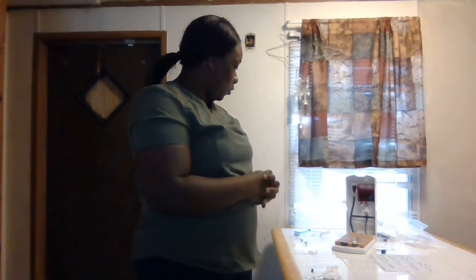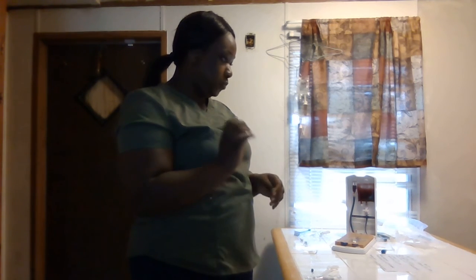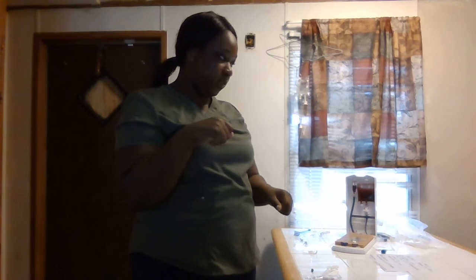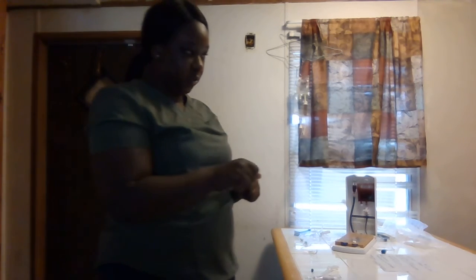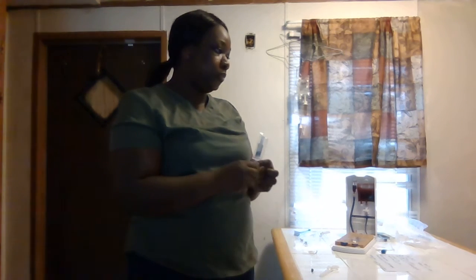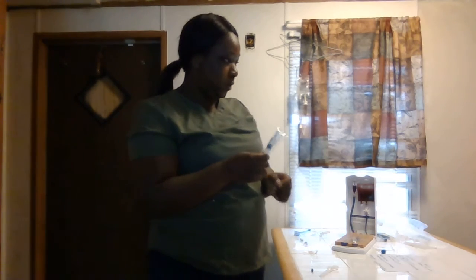Always clean off your extension port with alcohol for 60 seconds. Going to insert my saline syringe, but we always aspirate to make sure we get blood return. Once we get blood return, we're going to flush it with the normal saline. And then that's when we're going to insert the furosemide. Yep, after we flush it, we insert the medicine.